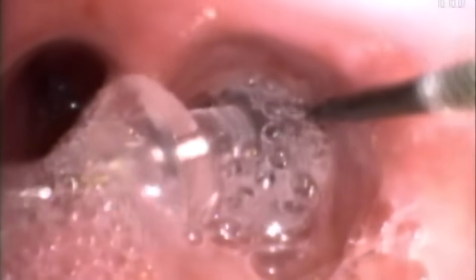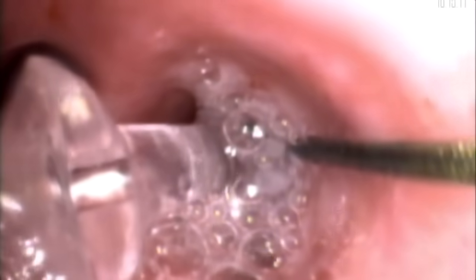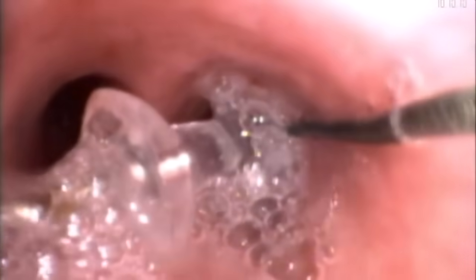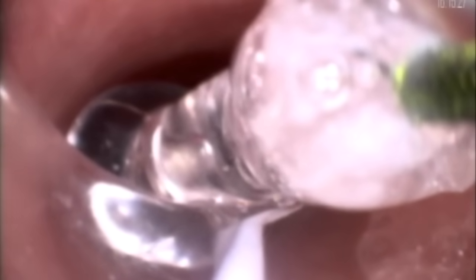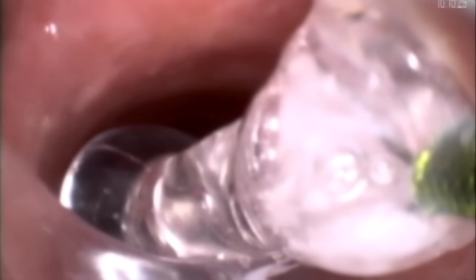With the pushpin now securely captured by the basket, we carefully pulled the pushpin to the distal tip of the endotracheal tube. Once we got the pin to the distal tip of the endotracheal tube, we paused for a minute to ensure that we had the appropriate equipment ready to re-intubate the patient.